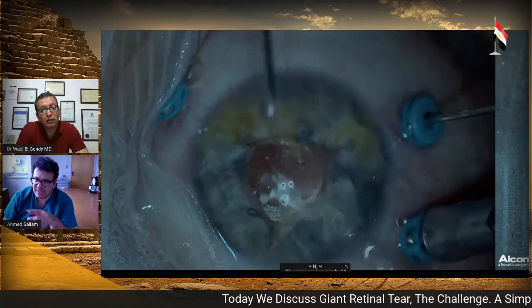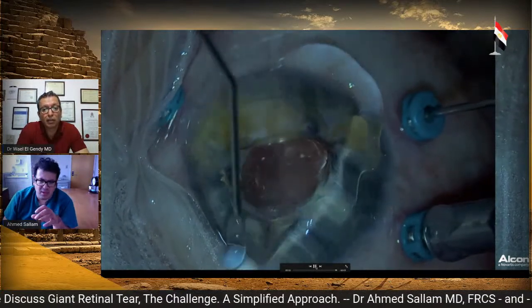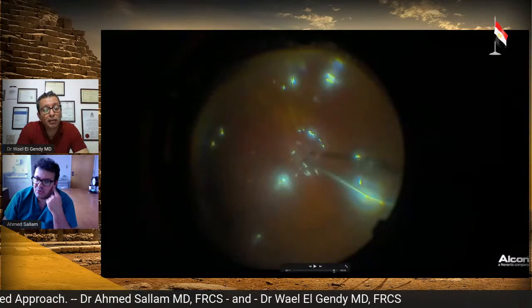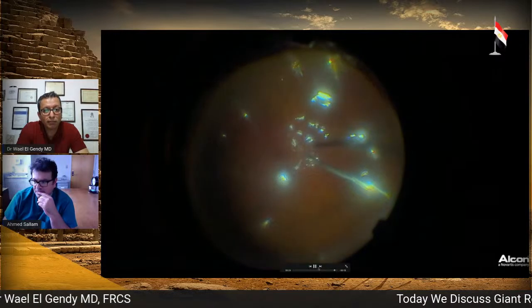And actually, this is the pupil in this case. That was a trauma patient who had pupilloplasty, so it's a small pupil. So things can get difficult. So you want to make sure to make things simple as much as you can, and mark.